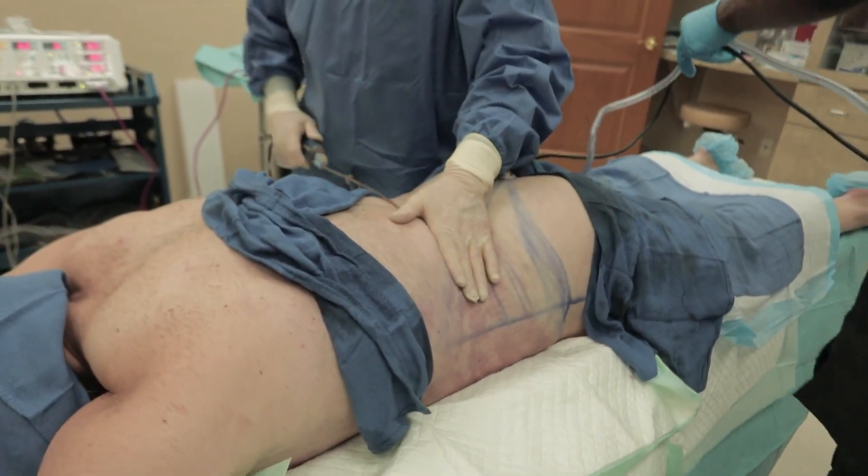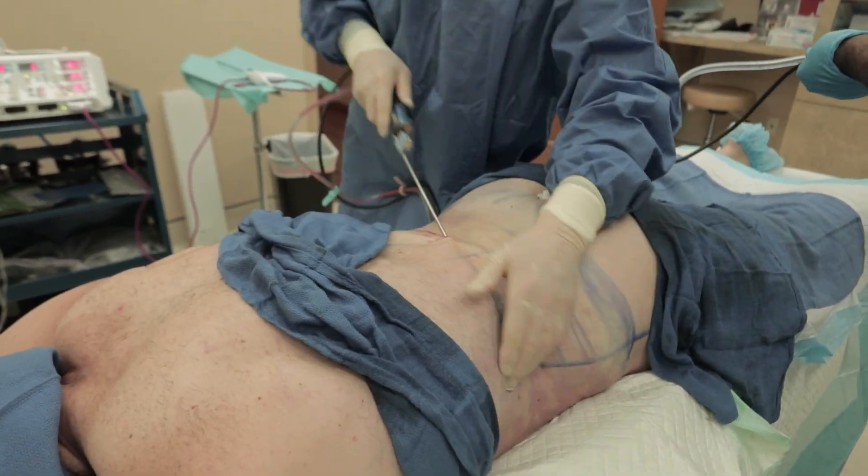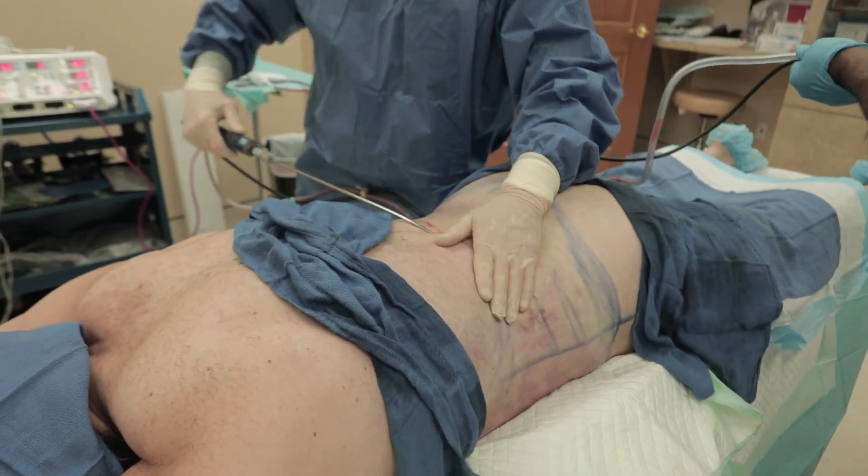Now the mid-back incision — get up here, follow the lats to the back, get that Christmas tree look.